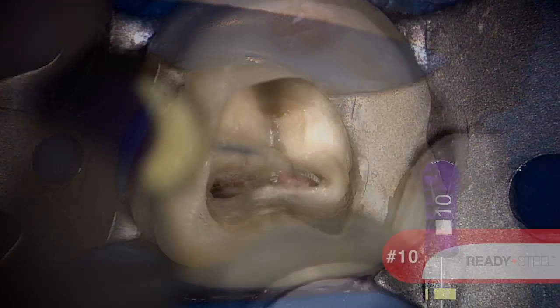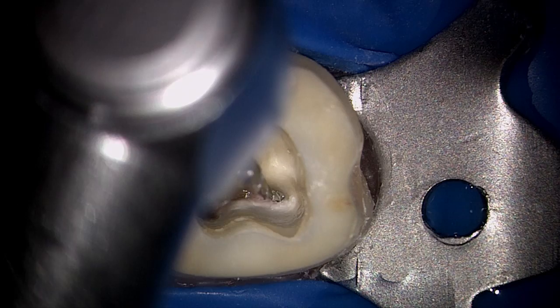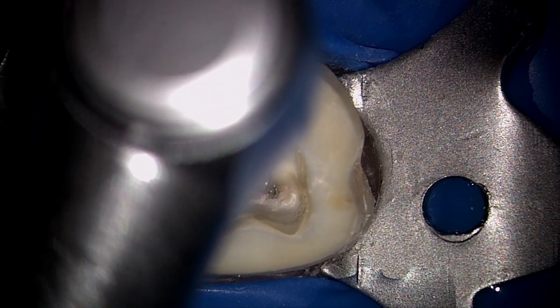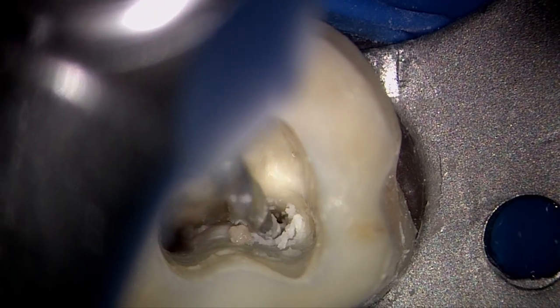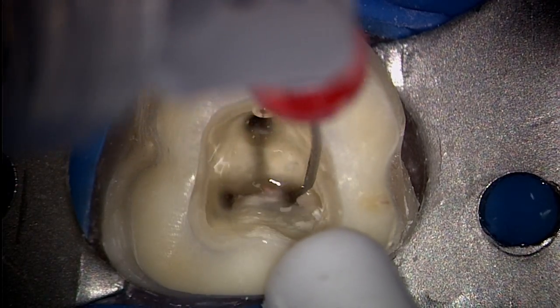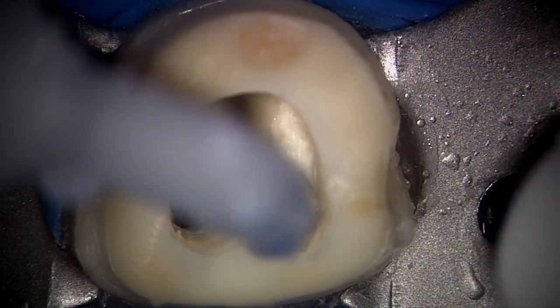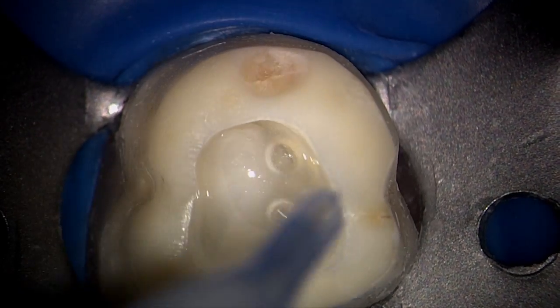A loose 10 file confirms there is sufficient working width to passively accommodate the end of the ProTaper SX file. Shaper X is used in a brushing motion on the outstroke to remove triangles of dentin, relocate canals away from external root concavities, and to pre-flare the orifice. Here I am placing a viscous chelator such as Glyde.